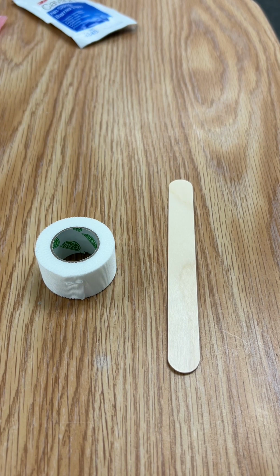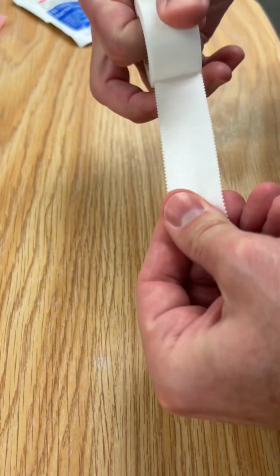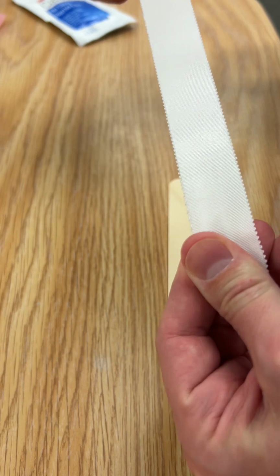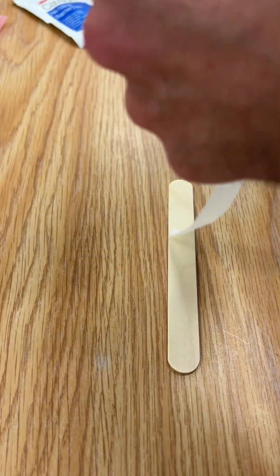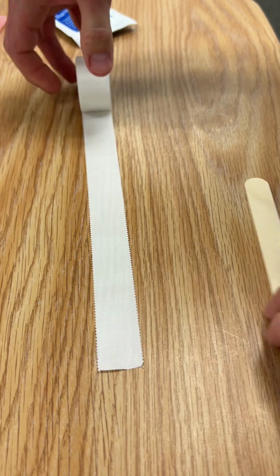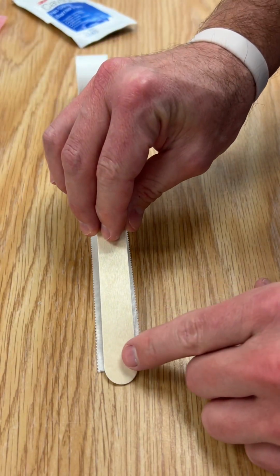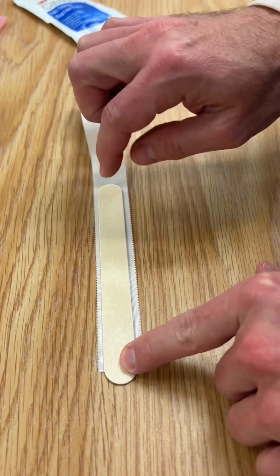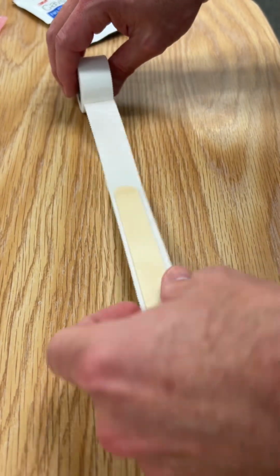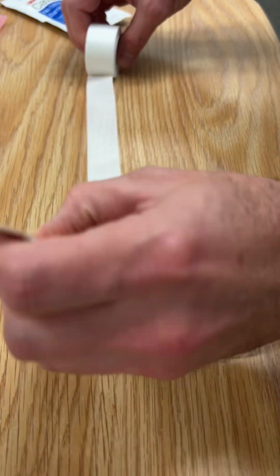If you want to use two, you can absolutely do that as well. I'm going to first pull off a piece of about 6 inches or so just to use as the piece that will be non-adhesive or non-sticky behind the neck. Next, I'm going to unroll another piece, and this is where I'm going to put my tongue depressor over it so that way it doesn't stick to itself. So I overhang the tongue depressor just a little bit over the edge. That helps make it a little easier just to unroll it when I need to later.